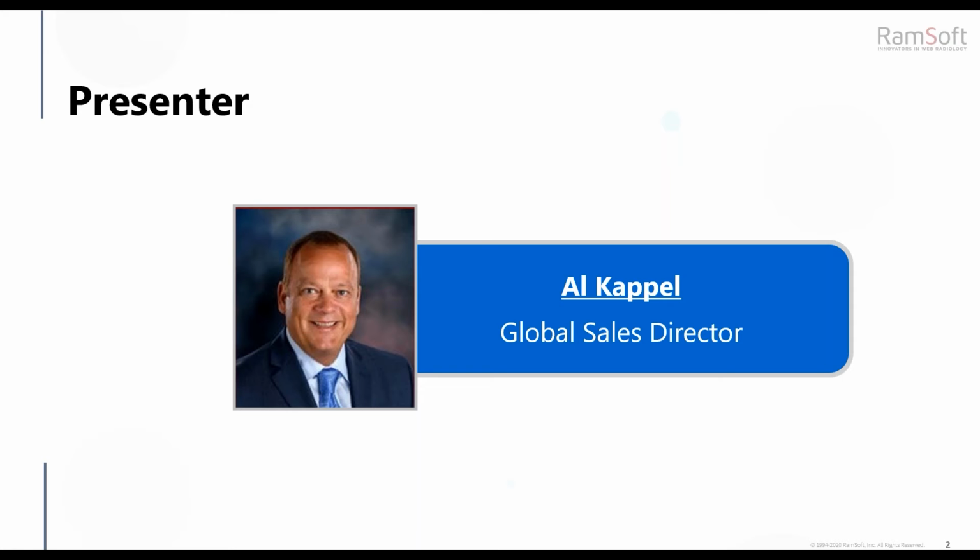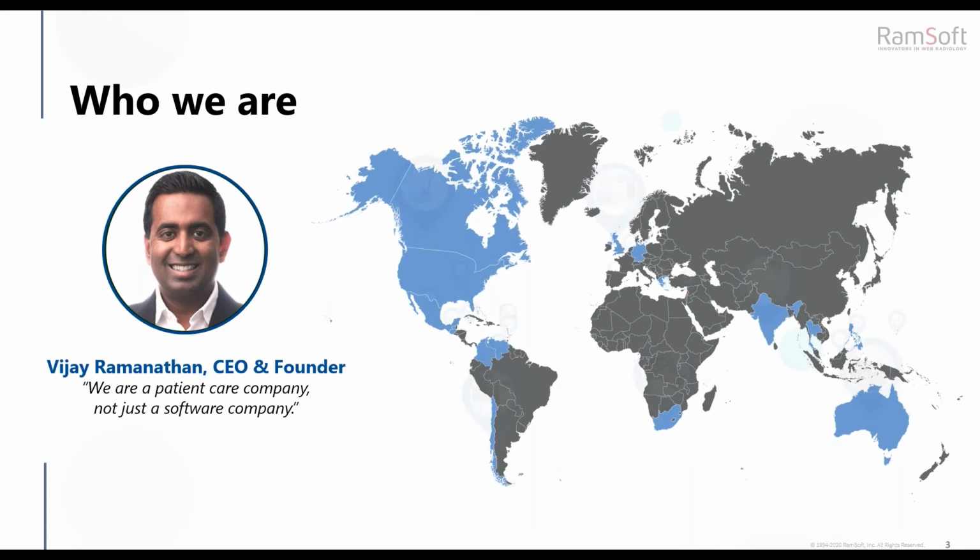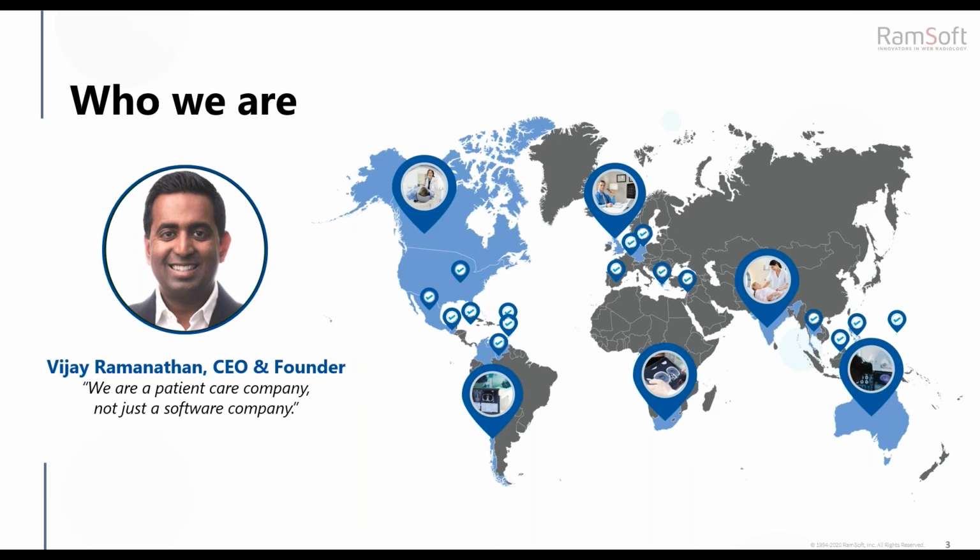Today we're going to take you through our technology to create customizable unified worklists. But first, a little bit about who we are. Ramsoft was founded over 25 years ago, and we're a patient care company, not just a software company. This ideology guides the way we envision, develop, and deliver solutions to our customers. With that in mind, we've developed software that is single platform, very easy to use, has an incredibly versatile and configurable workflow that's also highly scalable.